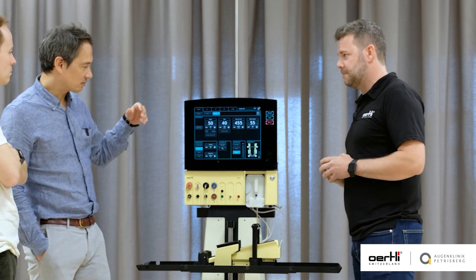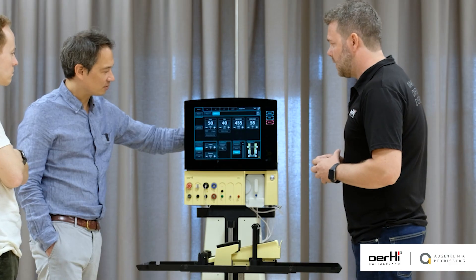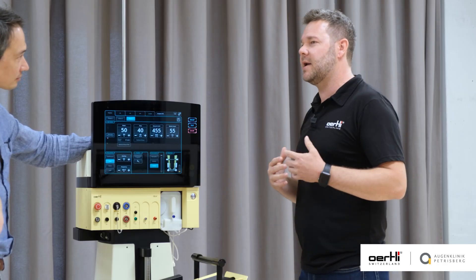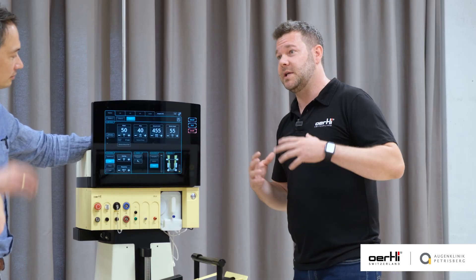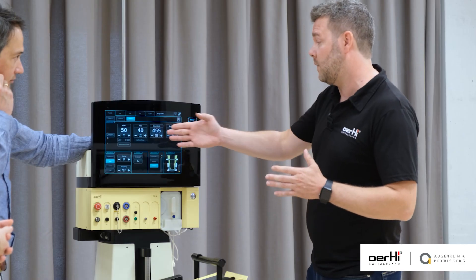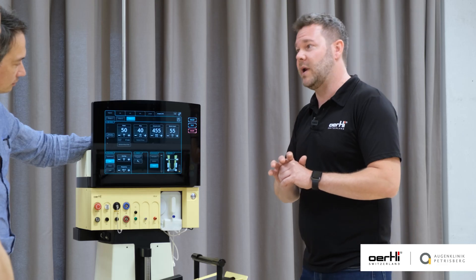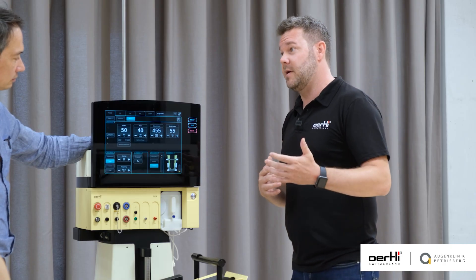Bottle height is always quite constant. How would you change settings for a younger or older surgeon? If it works for you, I wouldn't change anything. But for beginners, in my experience, higher values sometimes make it a little bit easier. With EasyFACO we like to work with occlusion, and when we use higher values — like a flow of 40–45 and a vacuum of 450 to 500 — it's easier for younger surgeons to find occlusion quicker. The more we work under occlusion, the better it works.